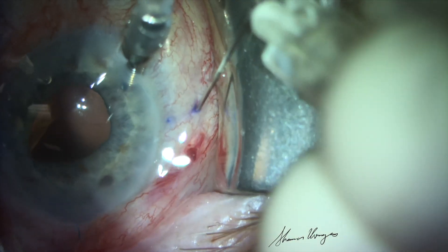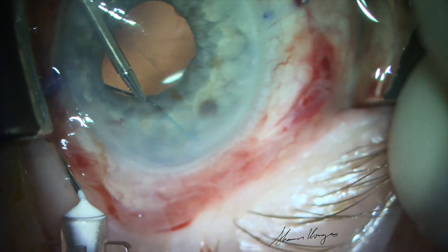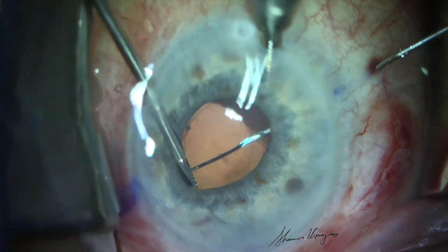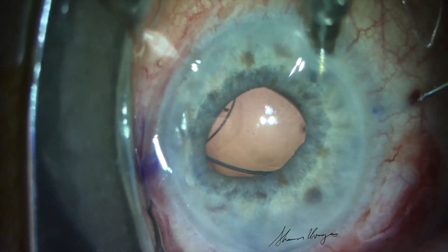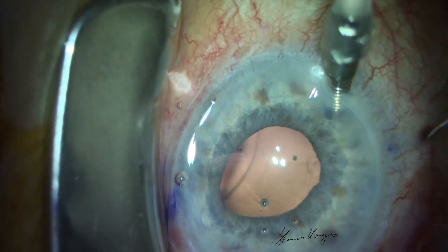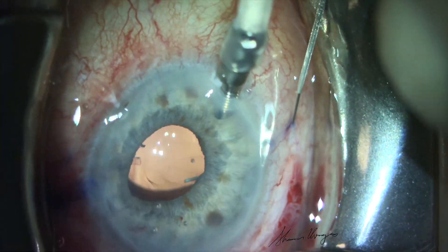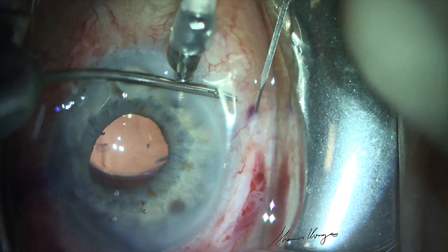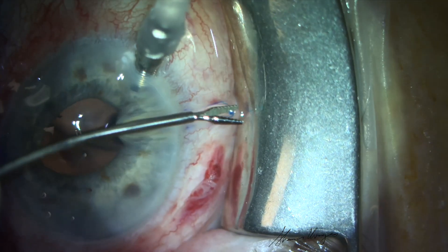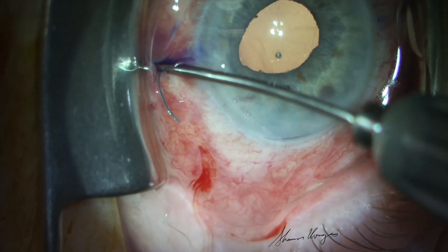While we work at the 3 o'clock position, the needle is left in the eye with the haptic at 9 o'clock. We enter the eye at 3 o'clock with the 30-gauge needle, grasp the inferior haptic and bring it into the eye with our 23-gauge MST micro-holding forceps. Note the ports that need to be created to allow the optimal angles for engaging the haptics into the needles. The 3 o'clock needle is then withdrawn and secured using the 23-gauge micro-holding forceps. A cautery is used to create a bulb to the distal end of the haptic. The needle at 9 o'clock is then withdrawn and cautery is again used to create a bulb on the second distal haptic.